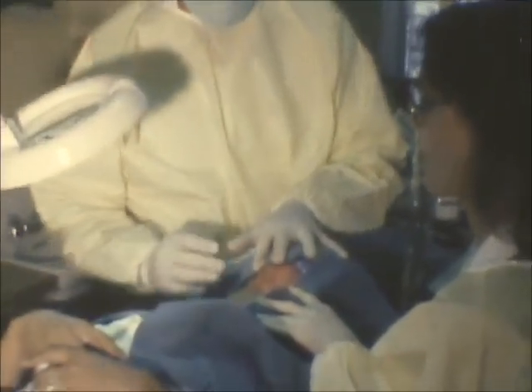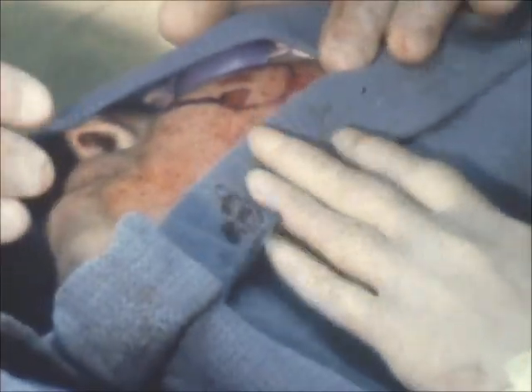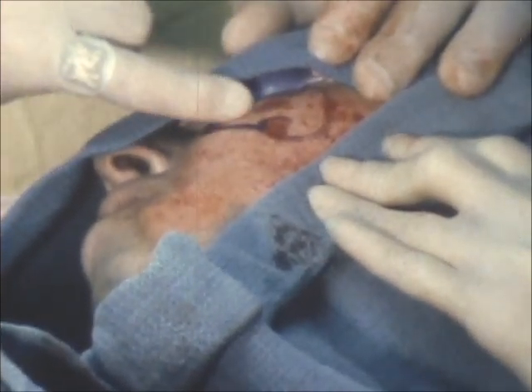In the second stage, sometimes we see deeper acne pits, which sometimes we mark with a marking pencil, but other times it's not necessary. We go over that area and try to blend it in with the rest. Occasionally we mark the deeper areas so that we dermabrade around the area, smoothing out the entire surface. We'll do that in this case — this irregular patch with the darker areas marked as deeper scars — and plane down the surrounding surface so that everything will be smoothed.